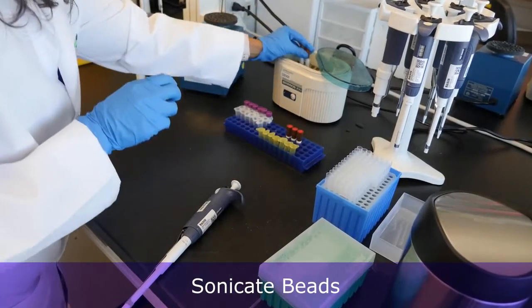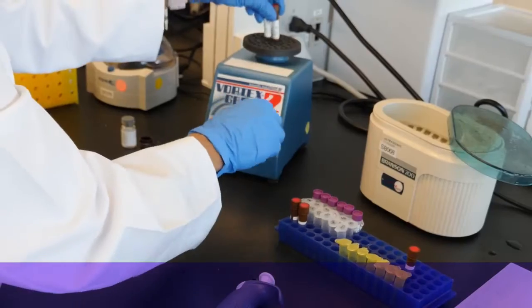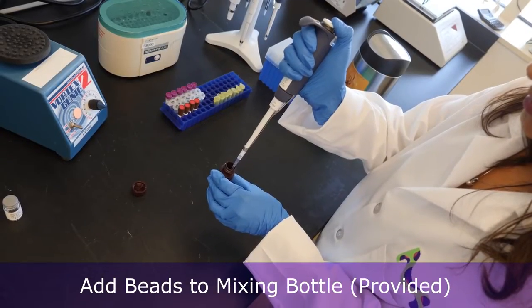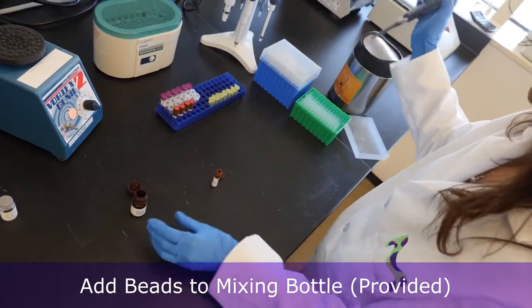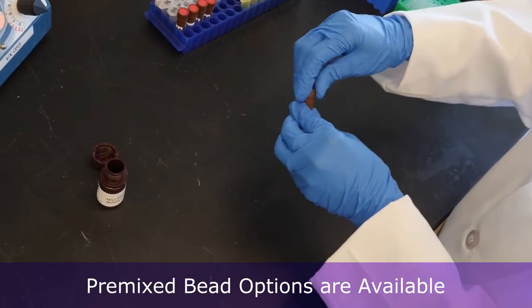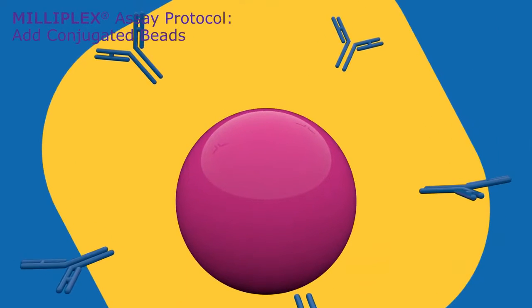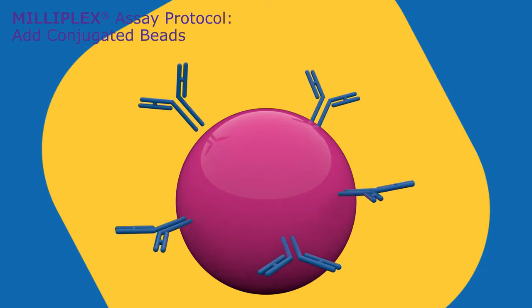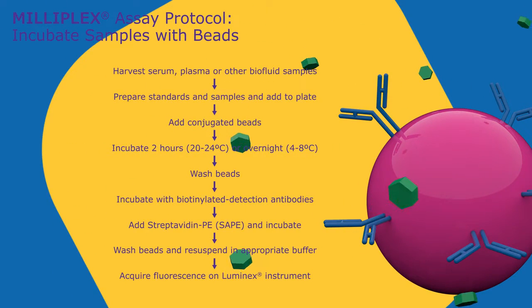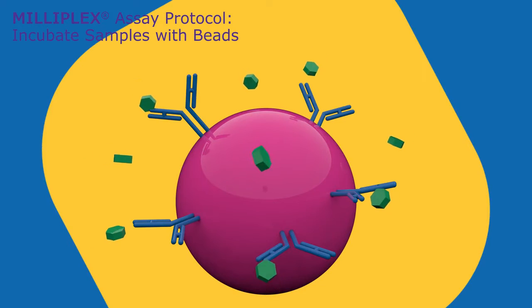Sonicate each bead vial individually and then vortex as instructed in the protocol. All beads are combined in the provided mixing bottle. We also offer pre-mixed bead options for selected panels. Beads are coated with antibodies or proteins to capture specific analytes in all Milliplex assays.